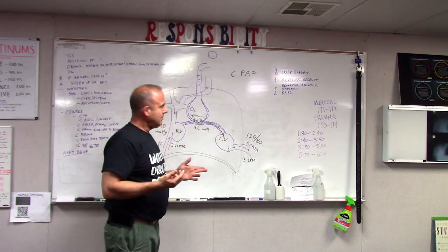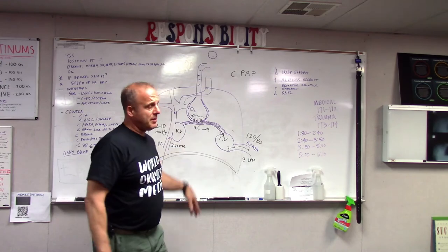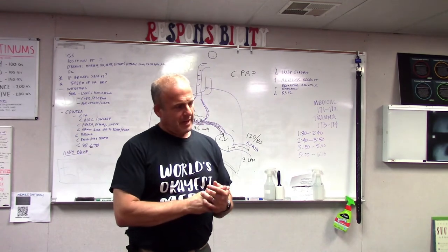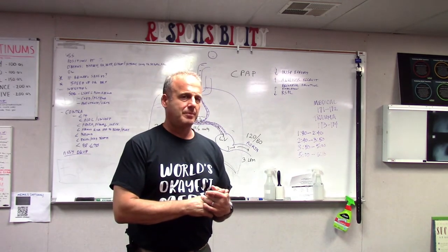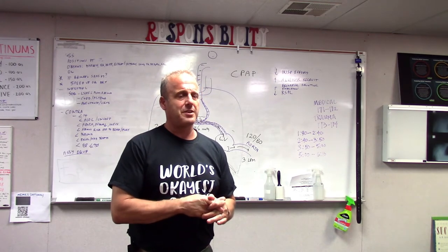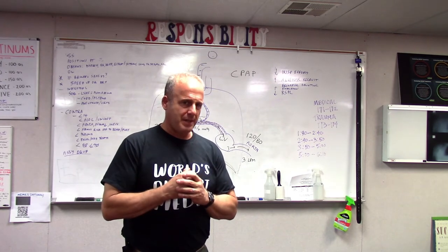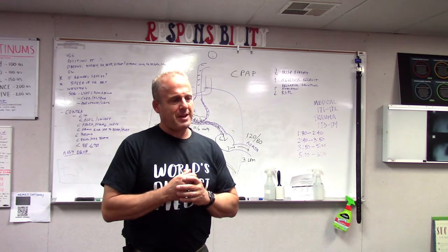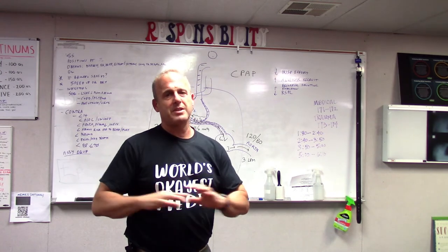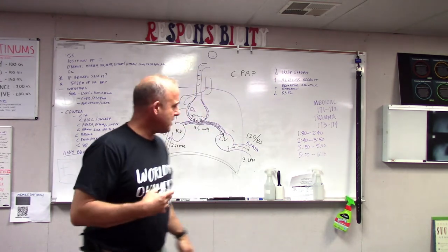And during exhalation, just in case you start to get wheezing, this is a hot topic here, but if you get pulmonary edema because of left-sided failure, you can develop what is, I don't know if it's official or not, called cardiac asthma. And no one knows exactly what causes that. However, there is a notion that if you get fluid in the lungs, there is going to be some sort of reflexive, protective bronchial narrowing. It may be sort of like the body's way of slamming the barn door shut after the horse is gone. Whatever it is, it can cause wheezing, and that only makes things worse. So the CPAP may help the wheezing, although bronchodilators can do that as well.